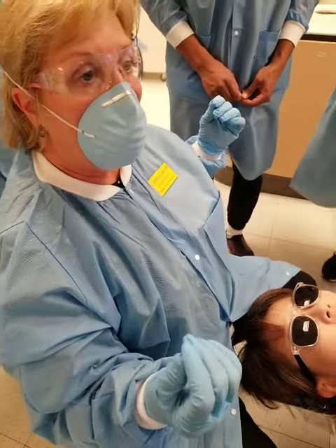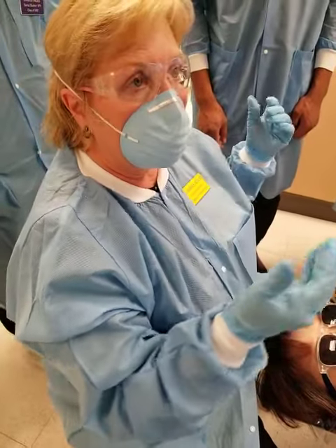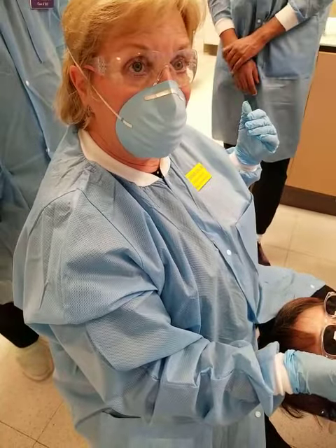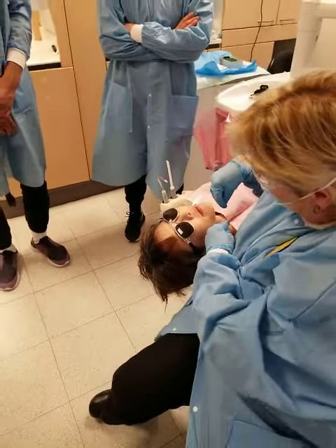When we test you, if you're a right-handed operator, we'll probably tell you a certain tooth, and if we ask you to do anything on the lower right buccal, I want you to turn around — the right-handed operator — bring yourself all the way around and go in like this to the lower right buccal.